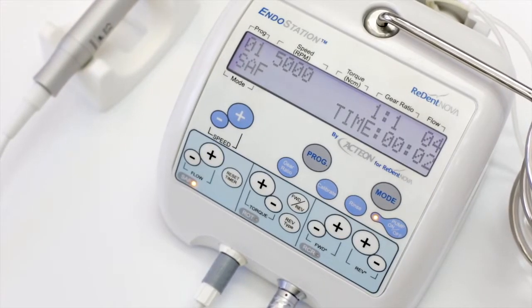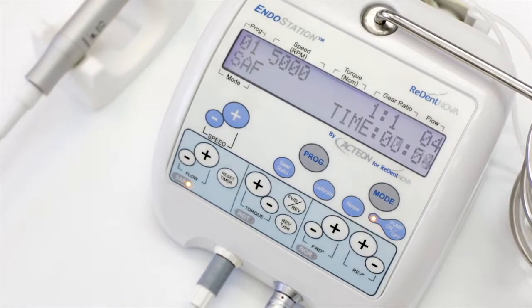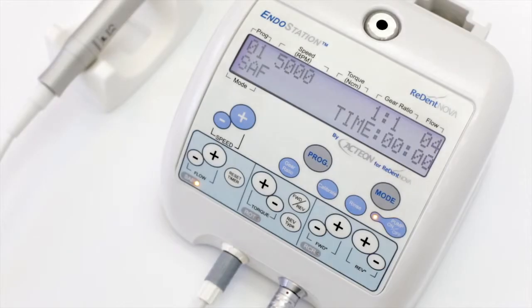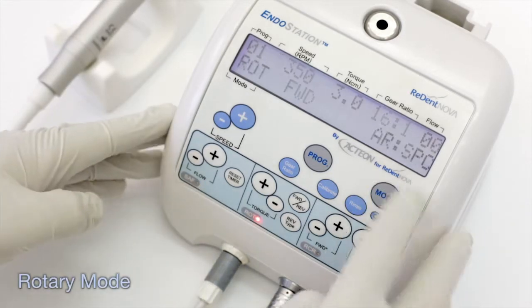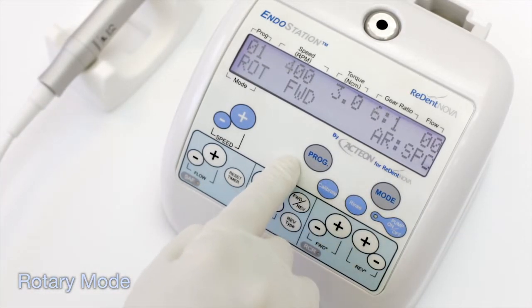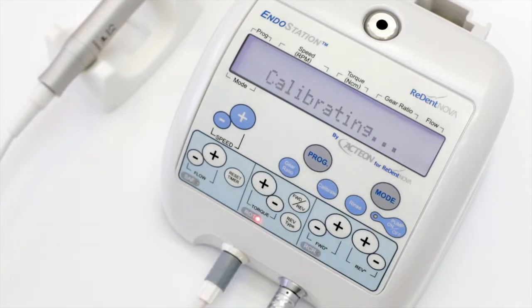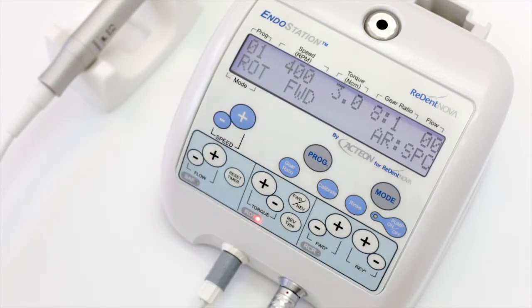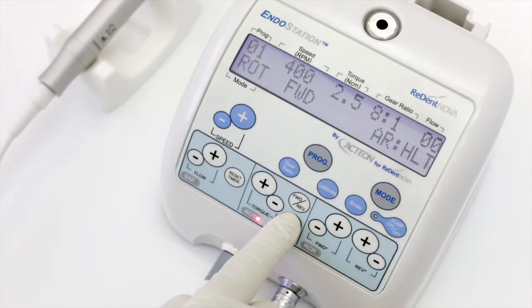The built-in timer counts the working time and should be reset whenever a new root canal is approached. When working in rotary and reciprocating modes, the irrigation system is disabled. For rotary mode, connect the suitable contra-angle handpiece, perform calibration, and adjust the speed and torque control levels according to the file system used. Rotation direction can be adjusted by the forward-reverse key, and the type of auto-reverse can be chosen using the reverse-type key.